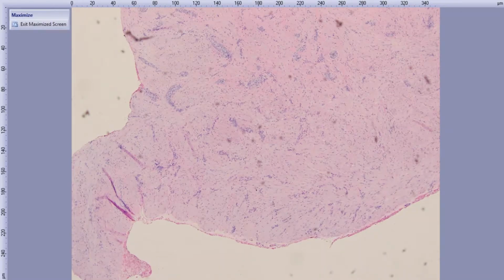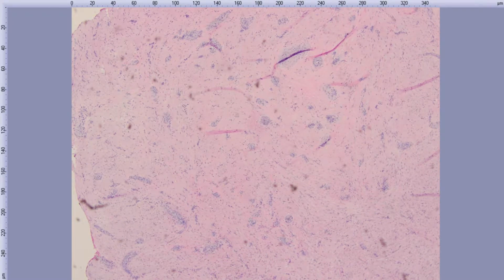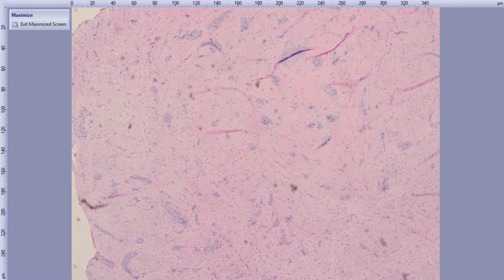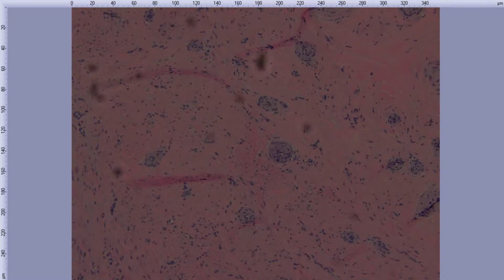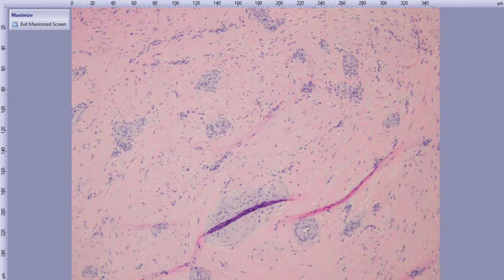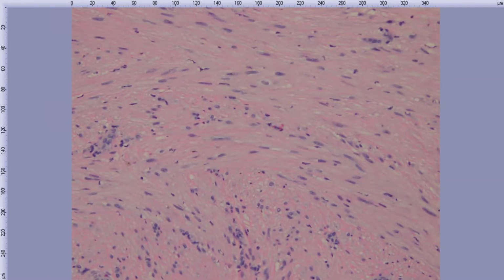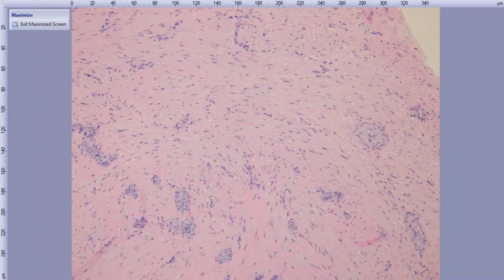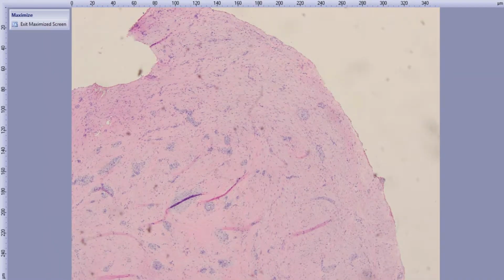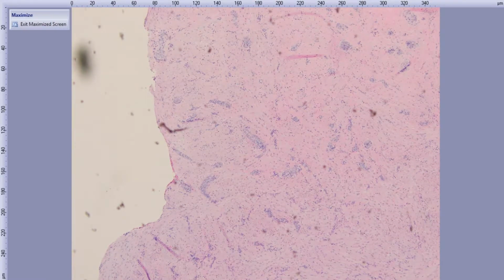You have this basically ball of tissue comprised of really, you can just break it down, two things. Angio, which is vessels, and leioma, which is smooth muscle. It's very compact, there's sort of no normal stroma in between. It takes over the whole area. And all these little circular areas here are all little vessels. And then you can see more of a typical fascicle of muscle right here. So together that's angioleiomyoma. There's not too much else that we see that looks like this for a differential.